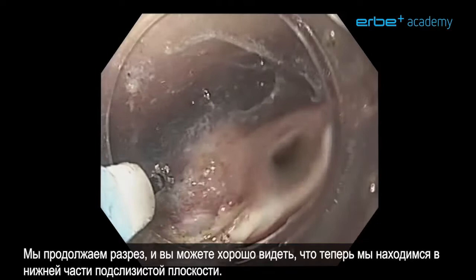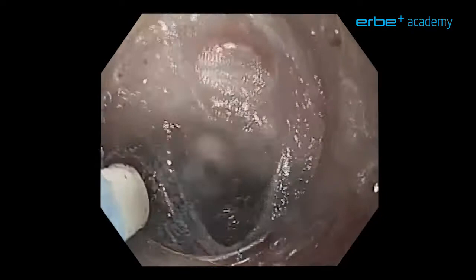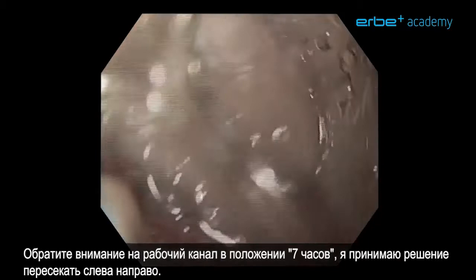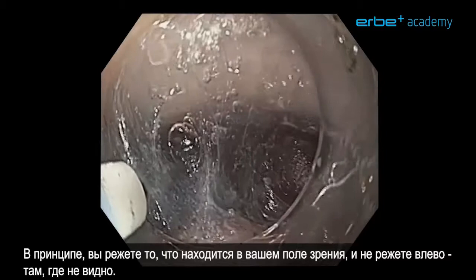We can continue cutting and you can see clearly we are now in the lower part of the submucosal plane. We will try to find the root of the vessel and treat it there. Notice with the working channel at the 7 o'clock position — I would like to cut from the left to the right side, so basically you are cutting what is in your view instead of cutting to the left side where you cannot see.